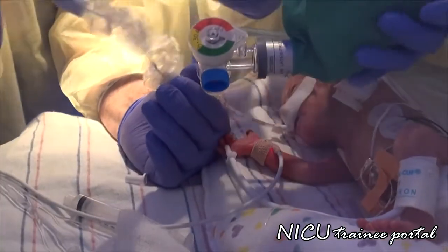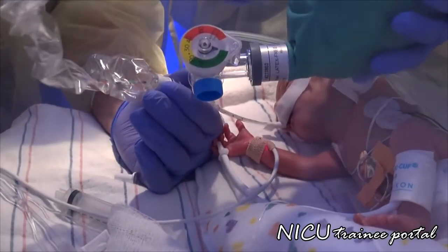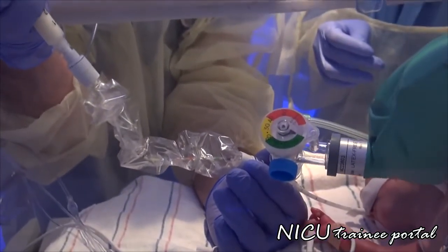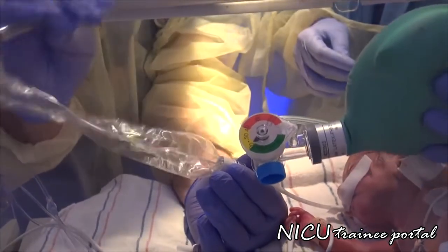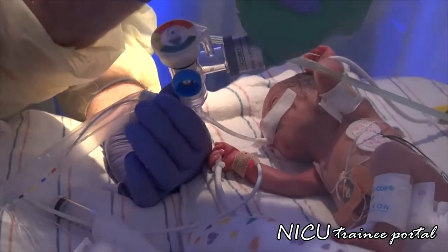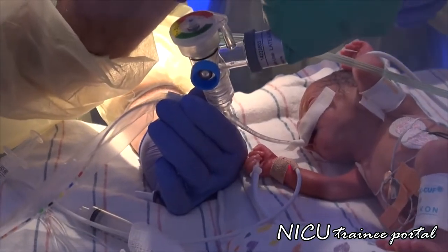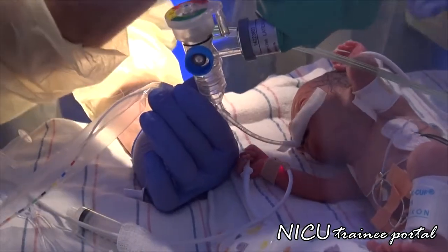Okay, here goes the half a dose. Yep, it should be back. Okay, thank you. Just grab it. Yeah, you take over.